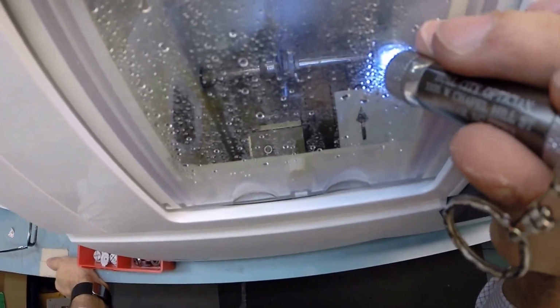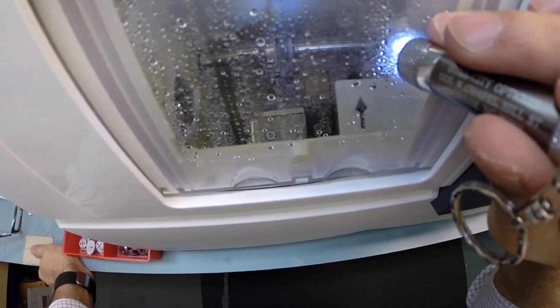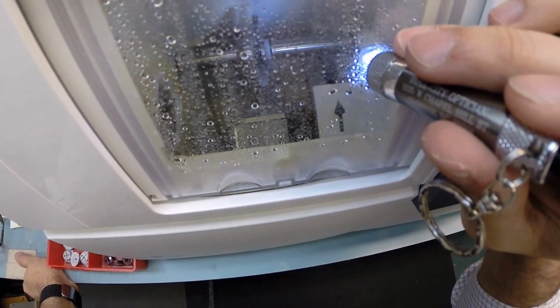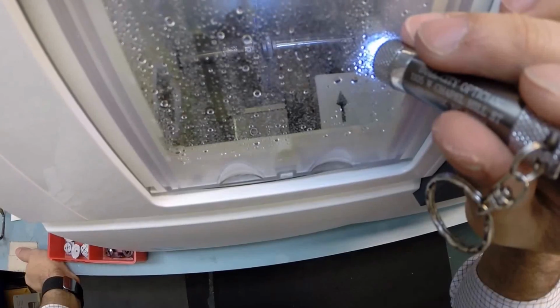The golden rule, if it's cutting wood or cutting lenses, you can always cut more off, you can never add it back on. So I have the machine start a little bit large and then I work my way down.